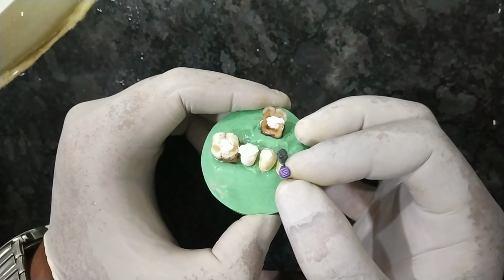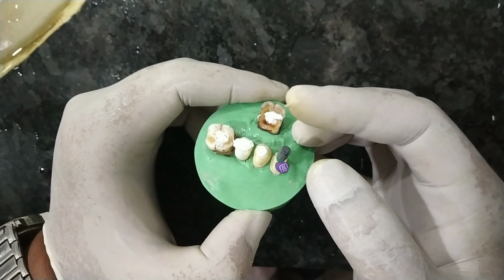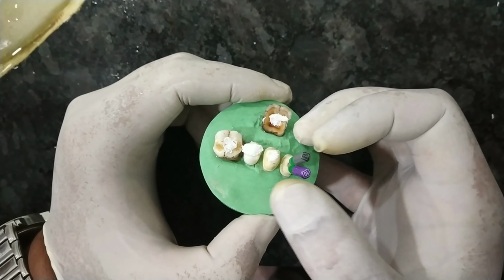After inserting both these files, we have to take an X-ray and know the working length of the tooth. I have already noted down the working length of this tooth. It's around 18.5 mm for the buccal canal and 19 mm for the palatal canal.